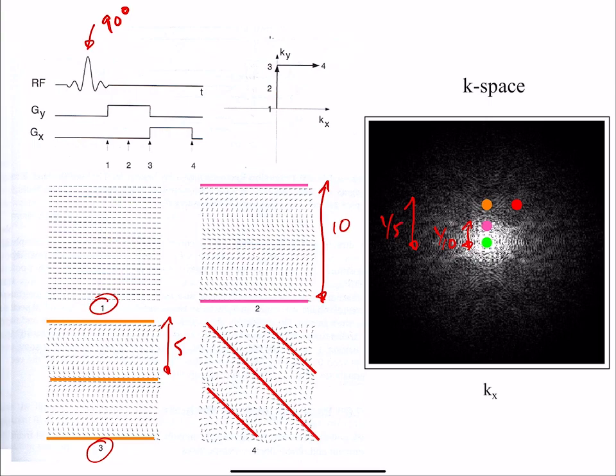All right. Question? So what is the sort of useful range in k-space if we're looking at repeating frequency, or what the period is in real space? If it repeats every 2 units, then in k-space it would be a half. If it repeats every 100 units, then it's 0.01. Yeah. So we'll get to that when we talk about how far out you want to go in k-space, but the answer is it depends on the resolution.